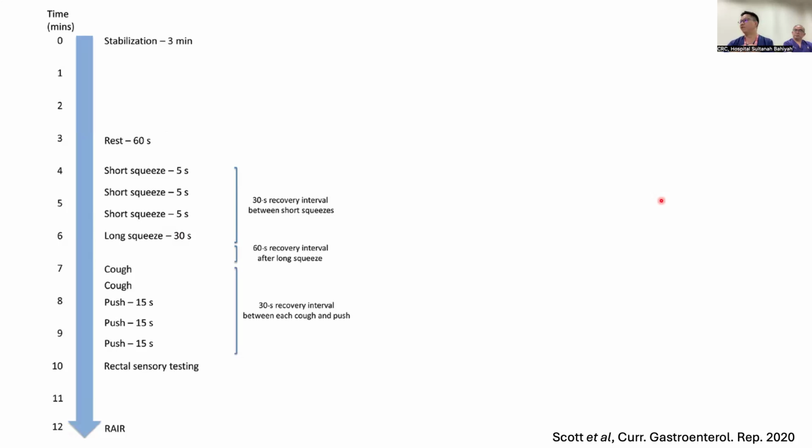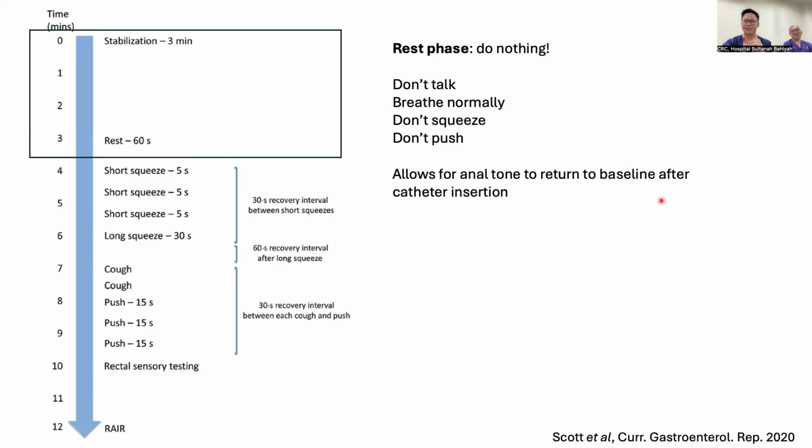This is the flow of an anorectal manometry, the steps that you do. I remember the first time I came across anorectal manometry when I was a second-year fellow. That time also Professor Lee came all the way over to Sarawak, and I remember going through this, I was so overwhelmed. It's like, wow, so much, it's crazy, the number of steps you have to do. But once you start doing it, you realize that you actually break it down into simple, short segments.